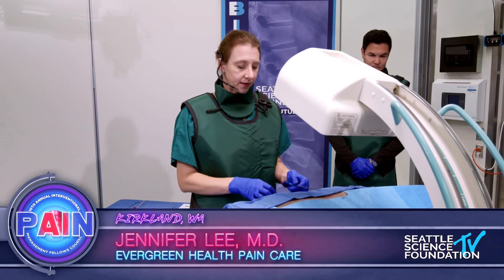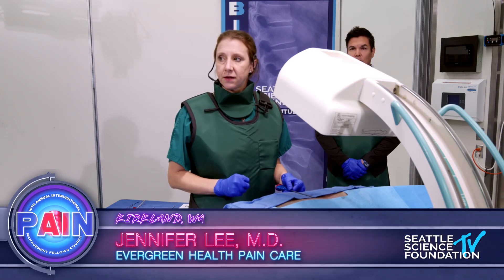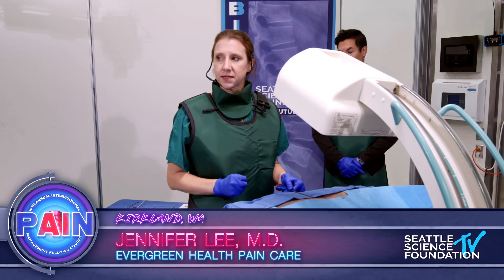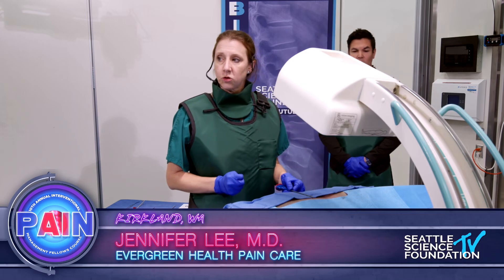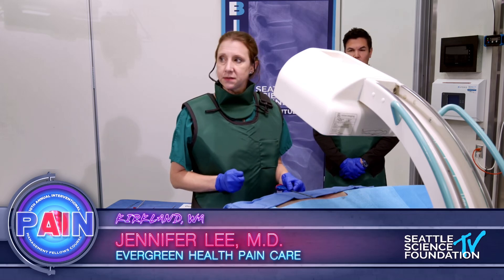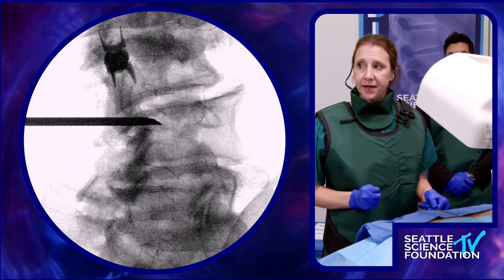I've gotten started here with my imaging. I'm at the L4 vertebral body and I squared the end plate on the superior aspect. I obliqued the C-arm ipsilateral about 15 to 20 degrees and I've focused my attention right on that pedicle.